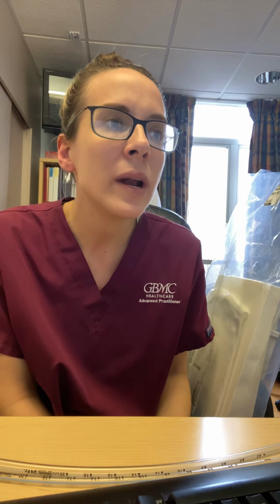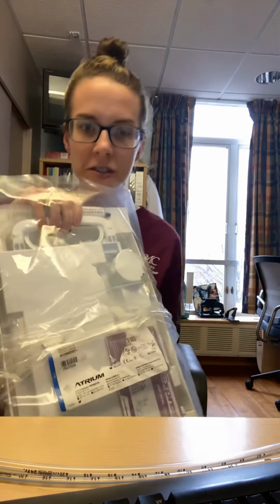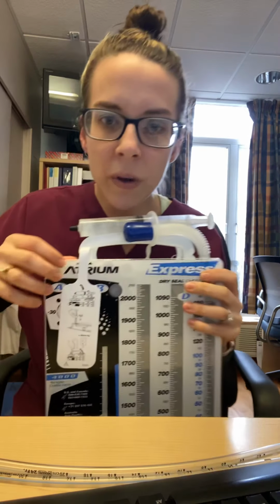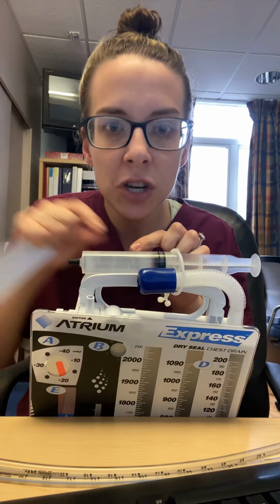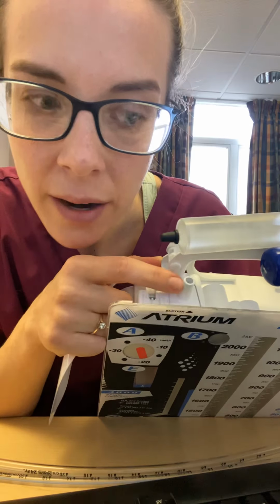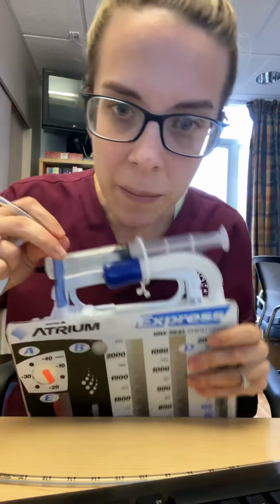So as long as there's adequate airflow from the wall suction, this is kind of confusing if you've never seen a chest tube before, but I'll take you through it. So actually, let me show you this real quick. So this is the chest tube, the Atrium. So when you go in the room, you're going to see this little white port here on the top. So just like an NG tube is connected to suction tubing from the wall gauge, the suction tubing should go directly on this little spout here. So pretend this is tubing coming out of the wall from the suction gauge. You literally make sure that it goes right on top of there.